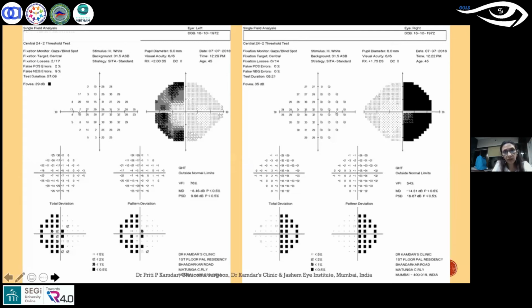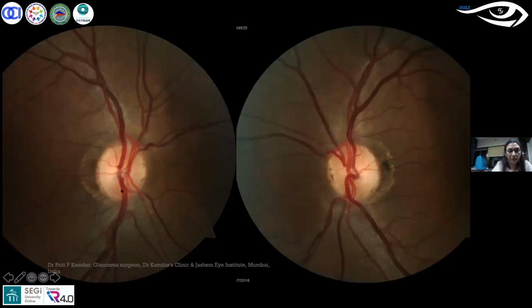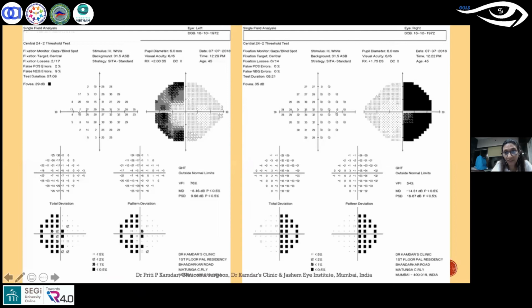Sometimes people say, oh, you can have optic nerve pallor and normal vision, and then you do a field and you will be surprised that there is a field defect. I say no. First you will have a vision defect. If you have a pituitary tumor, the first thing is it will affect your vision. Only the affection of vision will be so subtle, as it was in this case, that you will not even realize that the vision has been affected. So first it affects your vision, it affects your visual field, and then it will cause visible damage to the optic nerve. If you see here, there is no visible damage to the optic nerve, despite the fact that you have an advanced field defect in the right eye.